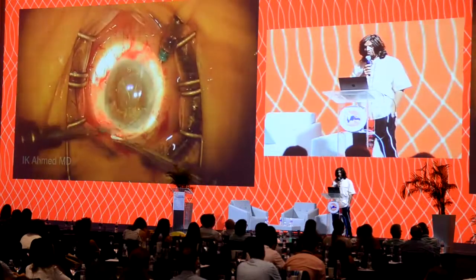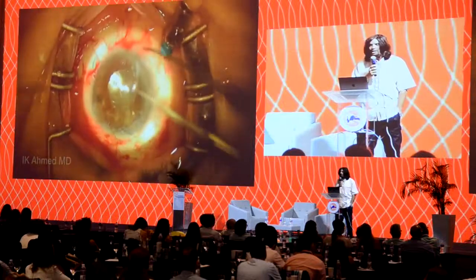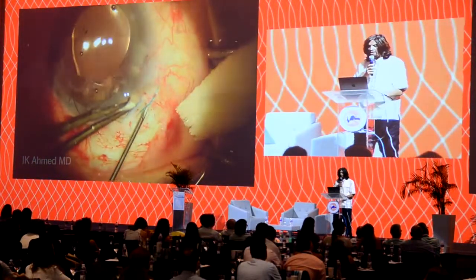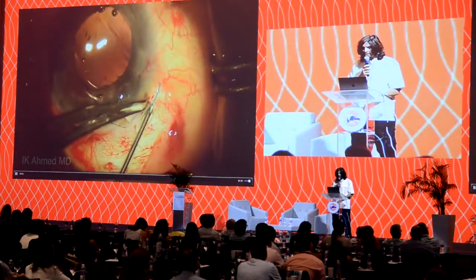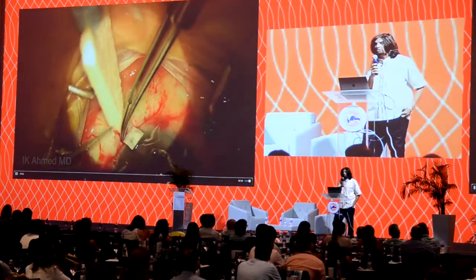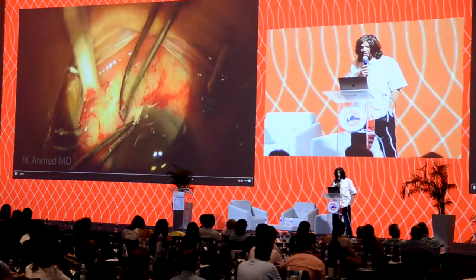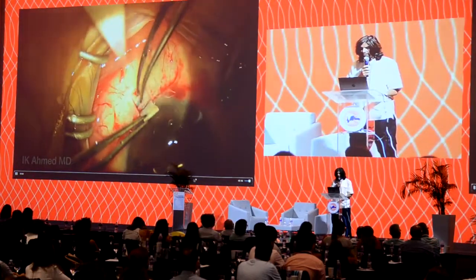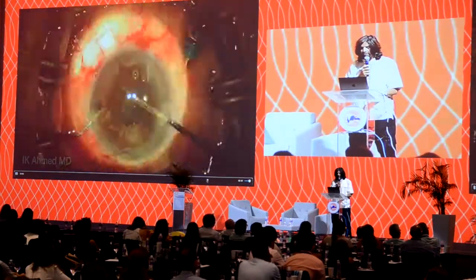It's a very clever technique described by Gabor Scharioth originally. Amar Agarwal has popularized it, and now Yamane has developed some further innovations here. We then basically make a small tunnel with a 26 gauge needle. And these have been quite reasonably positioned in our experience. The haptic sometimes can get twisted. You have to be careful not to pull the haptic and twist it too much, otherwise we get a bend and get some tilt on the lens. And we now have the lens positioned there as well.